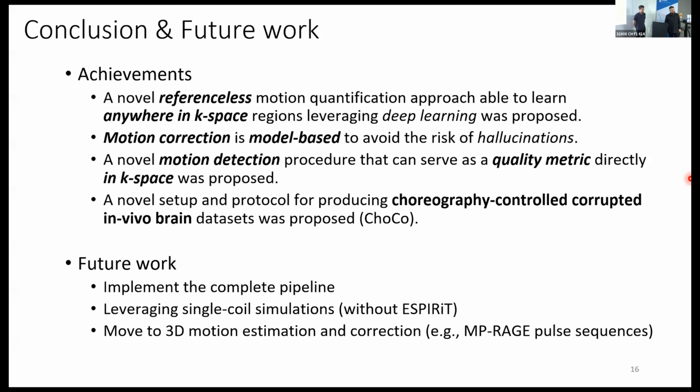Mm-hmm. And I see Joe raised his hand, but I just have one more question. Sorry. So how does this work with acceleration? So under sample data, do you first reconstruct the image using the coil sensitivities, and then you Fourier transform back to have some kind of full k-space? I think you're... Actually, we did not use acceleration here. Okay. The coils are full. I mean, it's the full data.